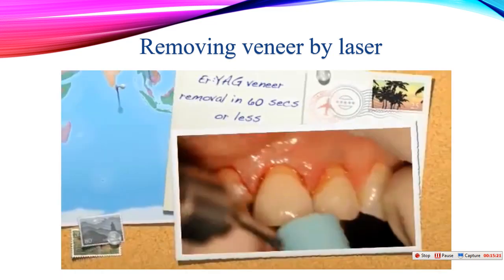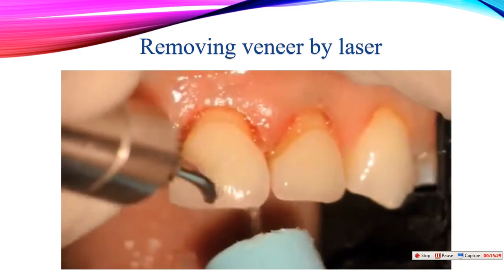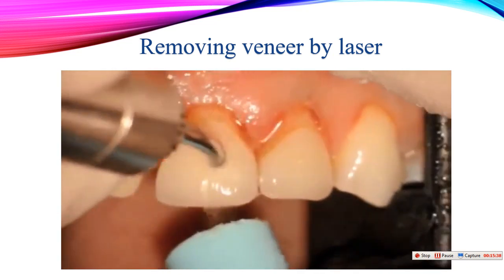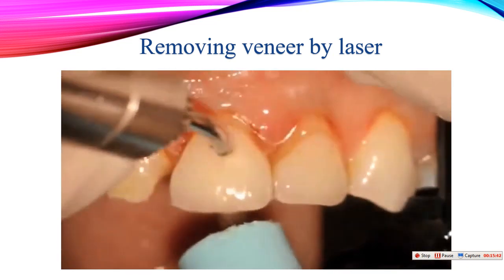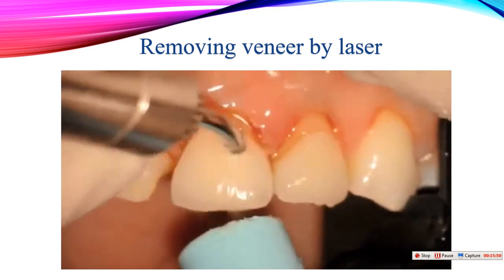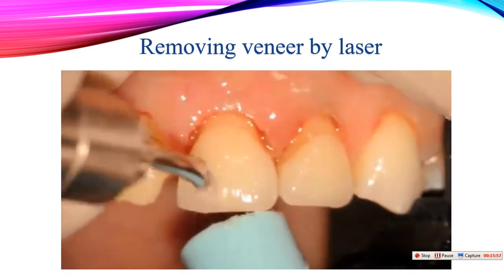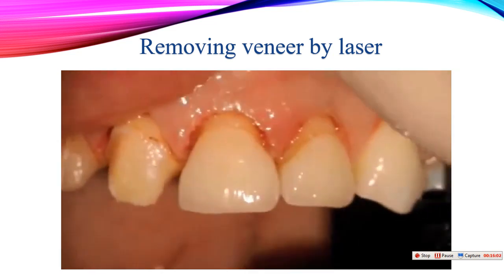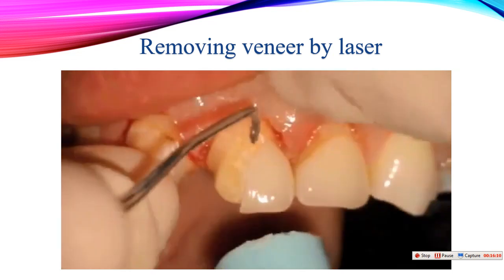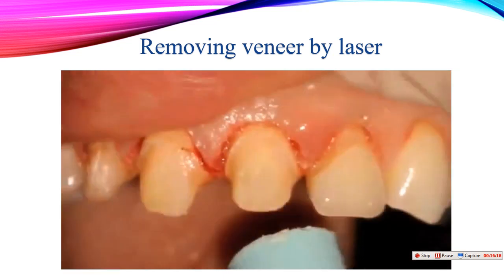So just when I start, tell me when I've got to 30 seconds. 30 hertz, 175 millijoules. Yeah, make it crack. 5 seconds. 30. That was 30. Let's just see if it will come off or not. Maybe I have to do a little bit more. Seconds.